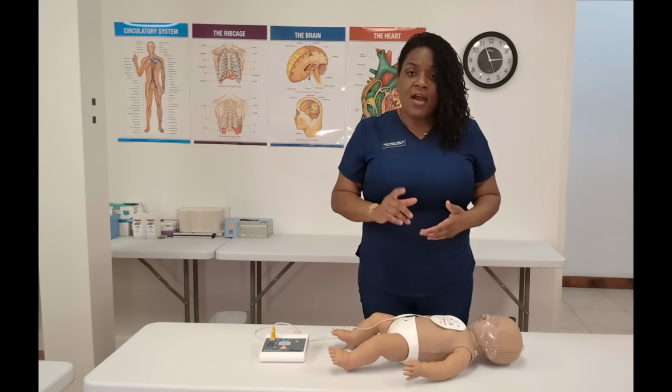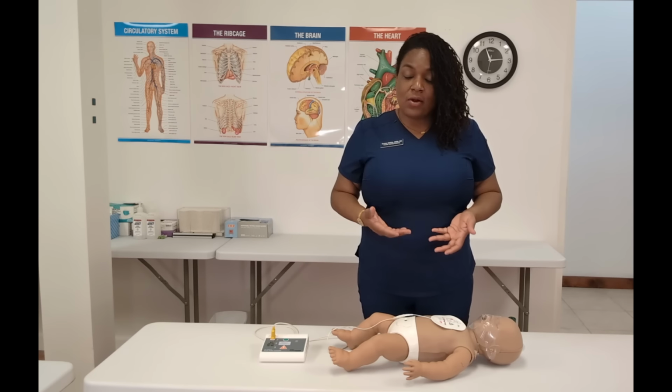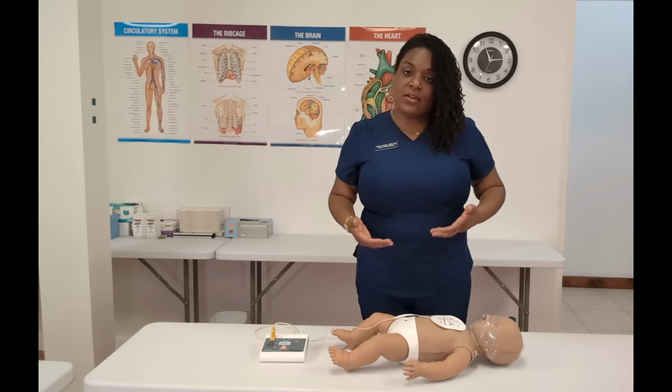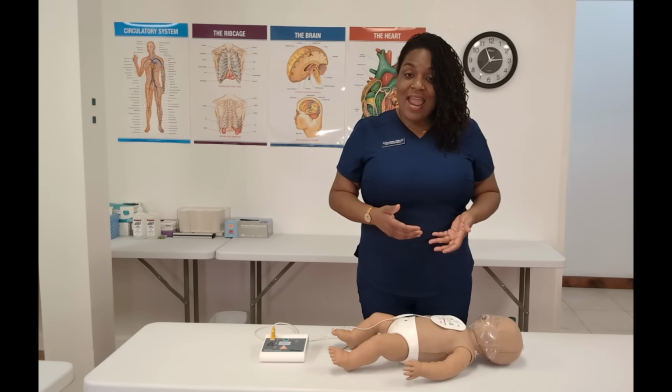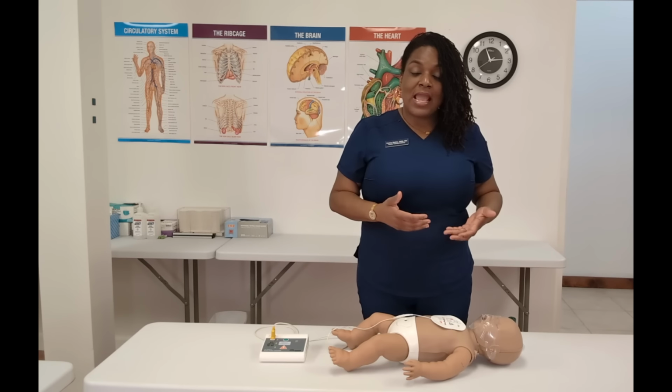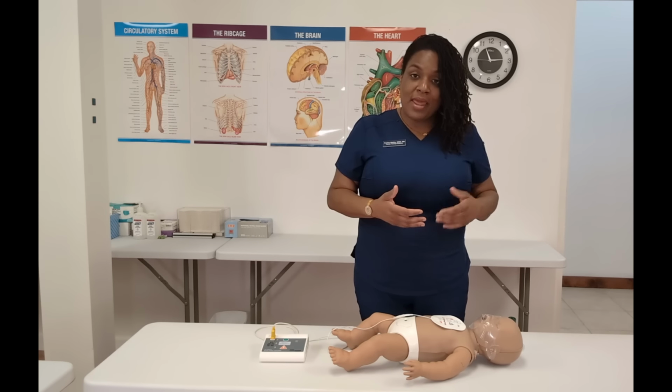For classroom purposes only, I'm turning off this AED because I don't want to talk over it. But again, in the real world, you would keep this AED on, and it's going to reanalyze every 2 minutes, and you would do that until the baby actually reaches final destination. And so again, if you're in a child care center, that could actually be whenever the paramedics arrive and they place their AED on.